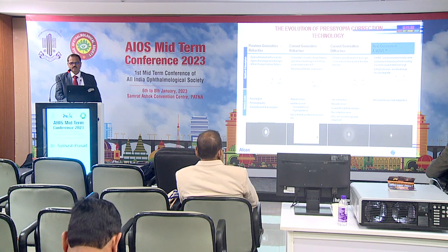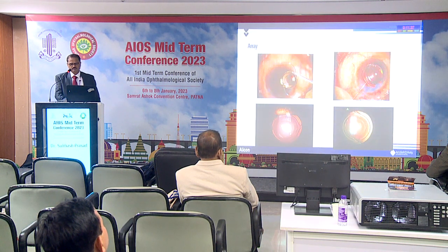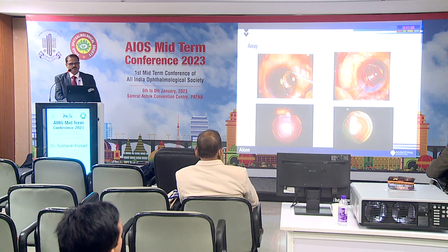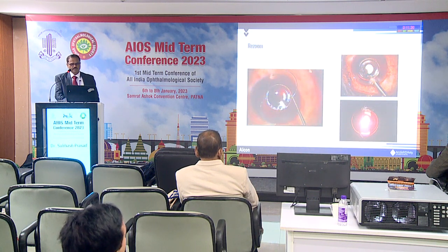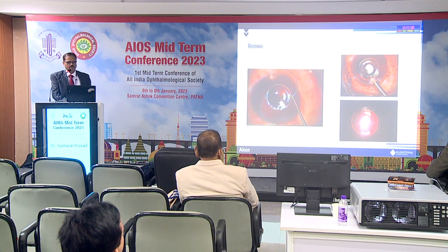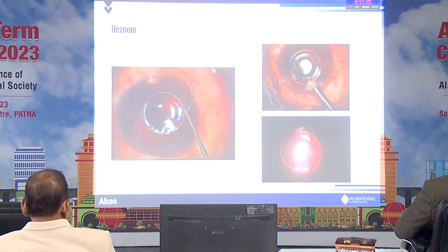The new lens which has come into the market is based on X-Wave technology, which utilizes a different kind of surface modulation, leading to this extended depth of focus vision, and that is the Vivity from Alcon. These are some clinical pictures of my Array lenses implanted way back, and then the Rezoom, which was also from that time, from AMO, Abbott actually, or Allergan, I think.